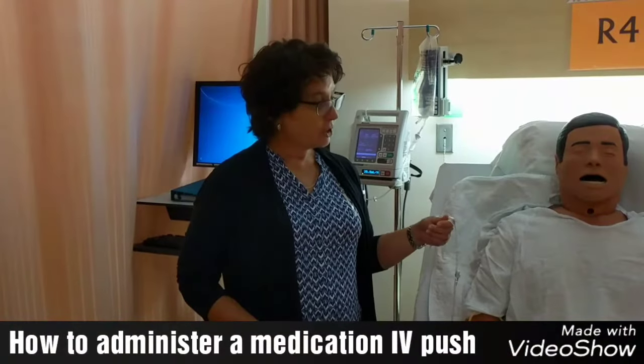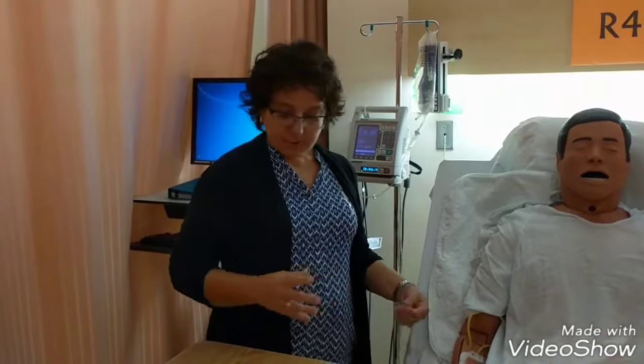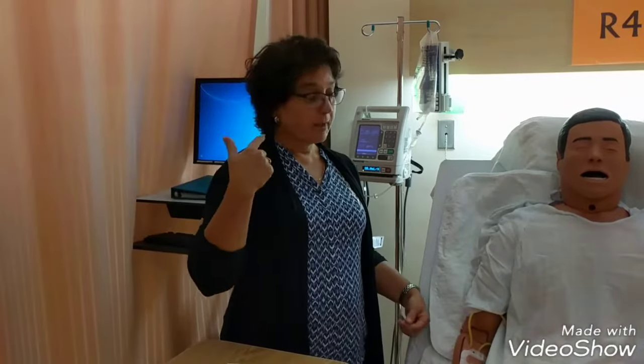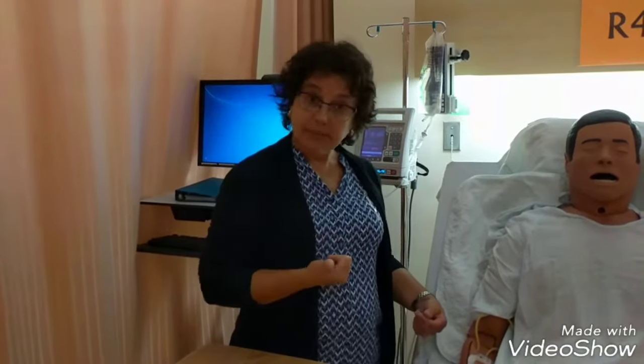Today we're going to be giving IV medication push to our patients who are running an IV line. First thing I'm going to do is check my order, make sure the medication I want to give — which in this case is morphine — is compatible with my IV solution, and that I can give it IV push, how much I have to dilute it with, and how long to infuse it.